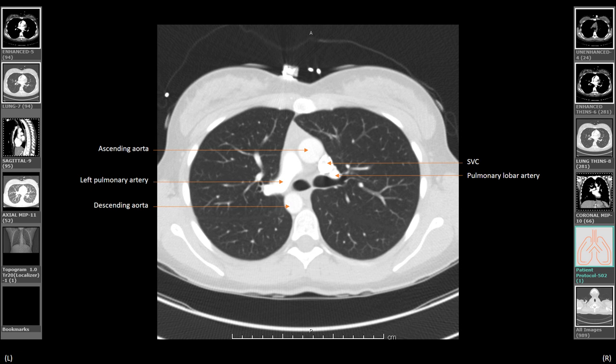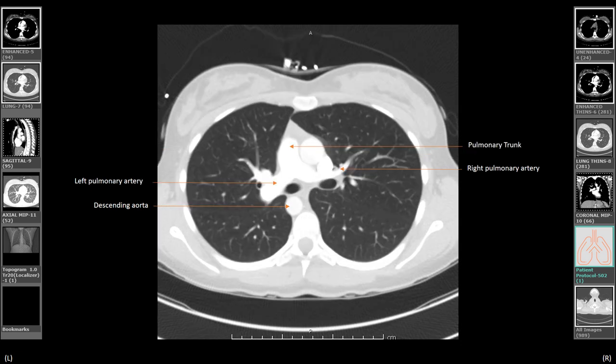As we navigate down the left main stem bronchus, the left pulmonary artery is anterior and continues its course laterally, giving superior and inferior branches. Note in this image, the descending aorta runs posterior to the proximal left main bronchus. The right pulmonary artery is seen anterior to the right upper lobe bronchus and the bronchus intermedius — there is no vessel posteriorly. Down into the left main stem bronchus, anteriorly is the left pulmonary artery and posteriorly is the descending aorta.